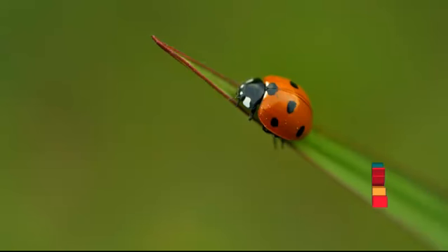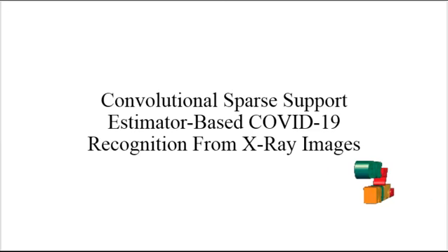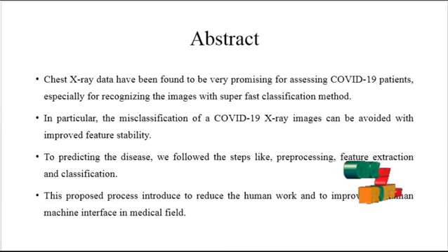Welcome to ClickMyProject.com. Now we are going to discuss the project, Convolutional Sparse Support Estimator based COVID recognition from X-ray images. Now we are going to discuss the abstract of the process.